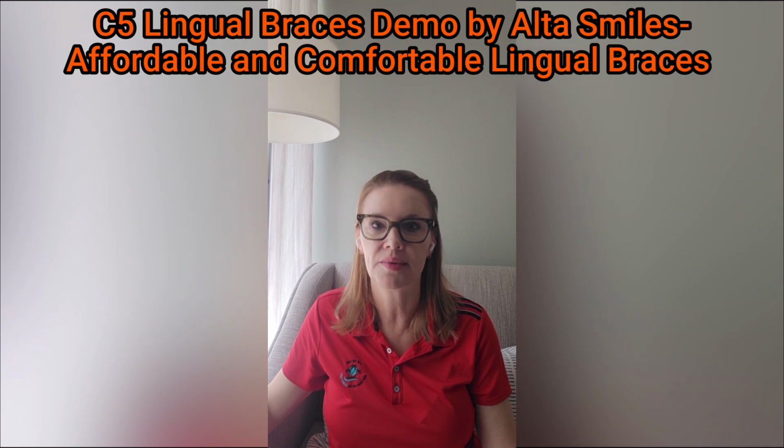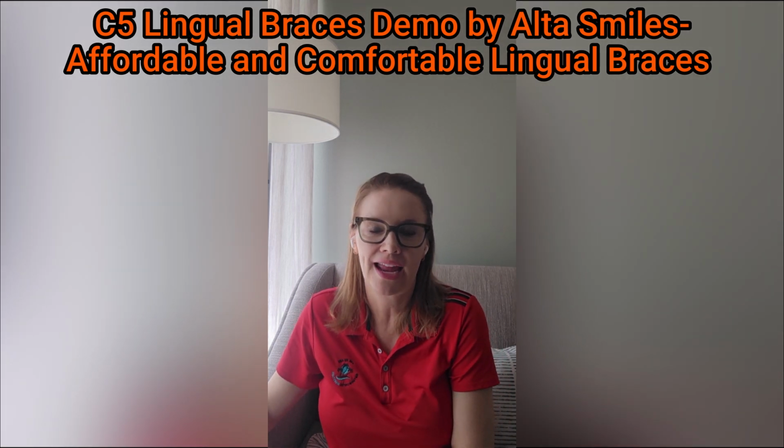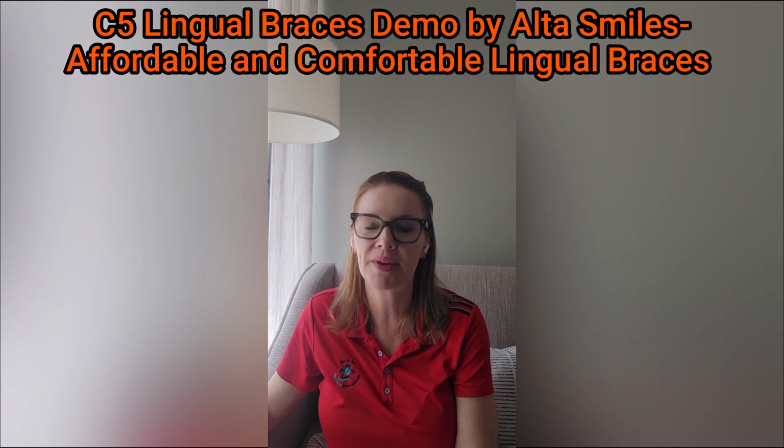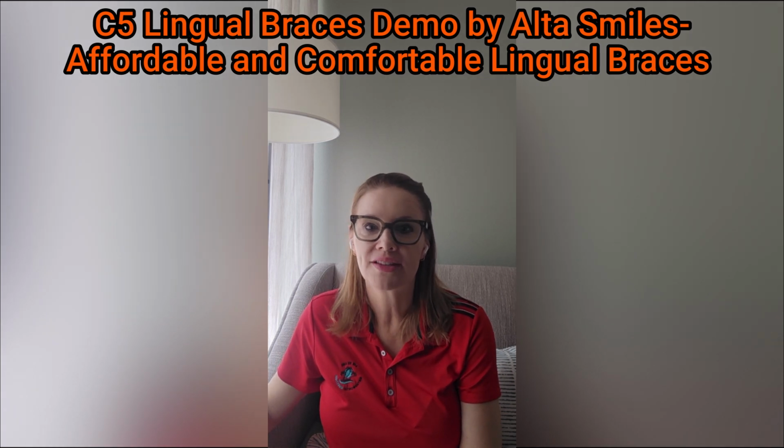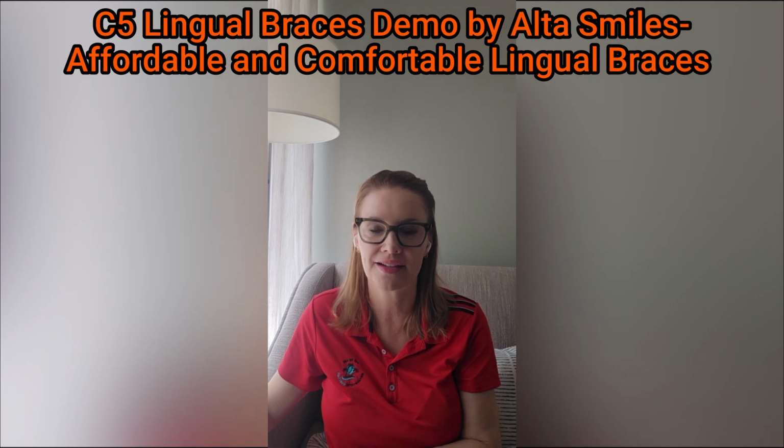Well, that's nothing new. I mean, they've had Incognito and all kinds of lingual braces out there. Have I ever done lingual braces? No, I had zero interest in it. It sounds like an absolute nightmare. If you're going to do lingual braces, your whole office needs to be set up for lingual braces because it is time consuming. It is basically like standing on your head in order to do the manipulations. The patients get all cut up because of the brackets on the inside of their mouth.